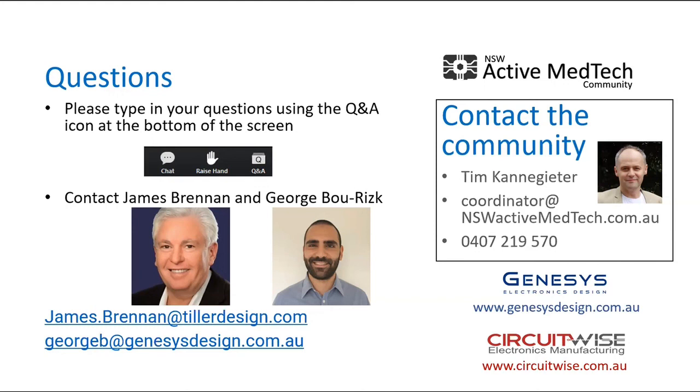The 100% failure thing comes out in a technical report on the application of ISO 14971 to software, and prima facie, it's absolutely ridiculous. That means you turn your PC on and it does its first instruction cycle and that fails. So why are we talking to each other now if software always fails 100% of the time? And as I like to say, bugs that occur 100% of the time, I like those because they're easy to find and fix.